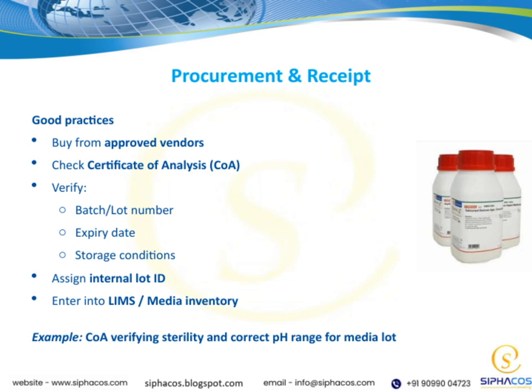Next, verify key information on the COA, such as the batch or lot number, to ensure it matches our records. Also, confirm the expiry date to make sure the product is still valid and safe to use. Don't forget to check the storage conditions listed. These are vital for maintaining the integrity of the material.